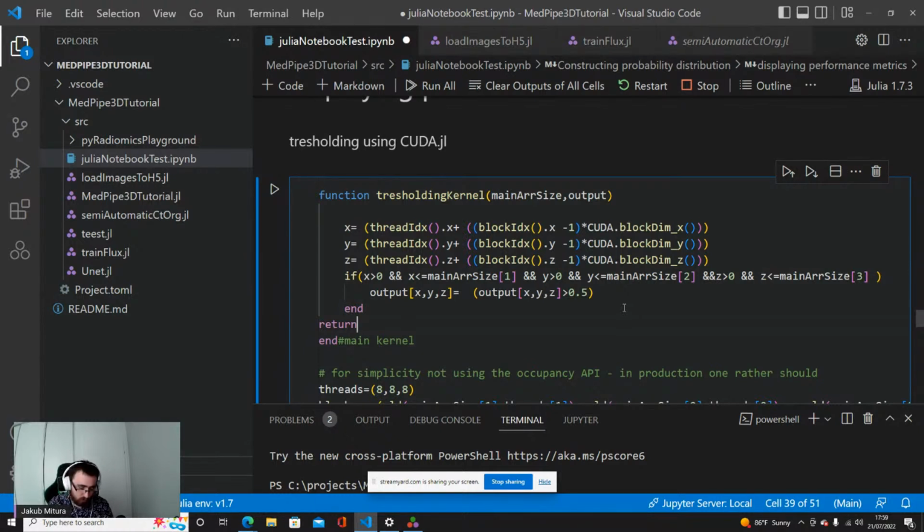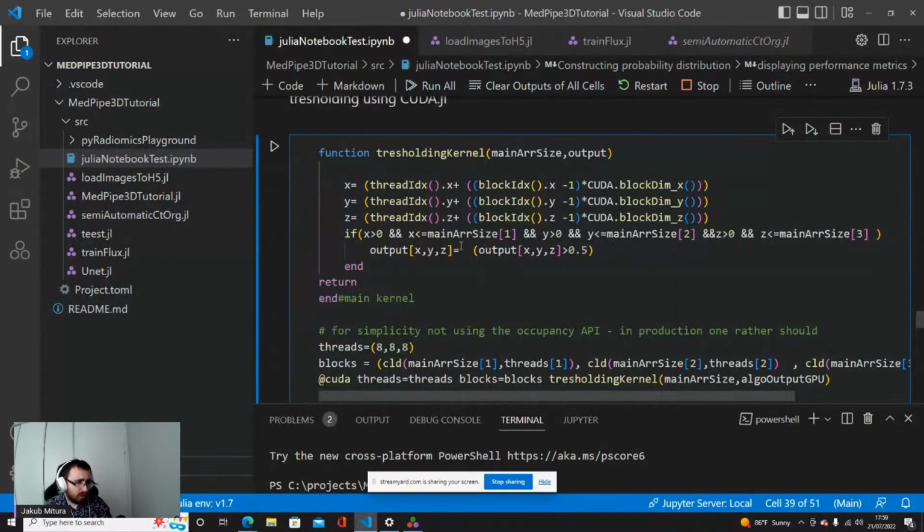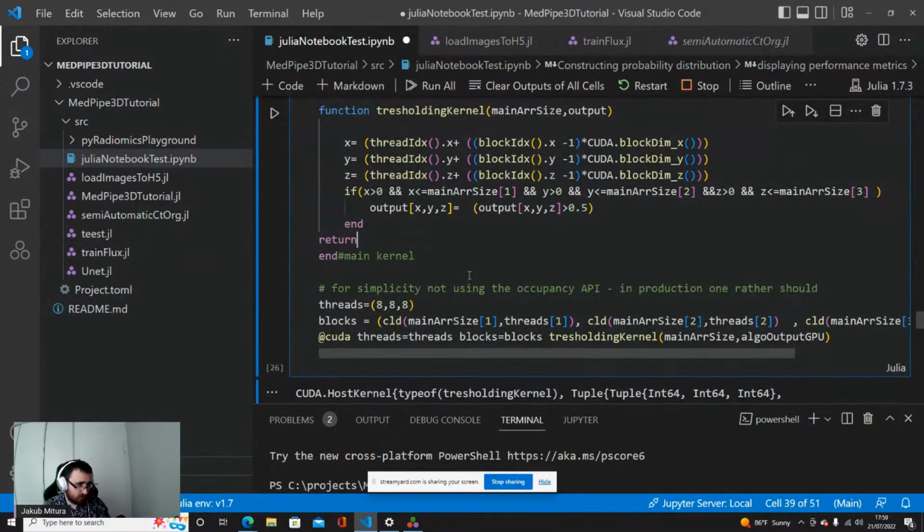In the context of optimization, the metric does not need to be easy to optimize. I define the metrics and I'm working on getting some new loss functions, but for now I have the metrics. And here we are not performing an optimization in this particular case, so this does not matter so much.